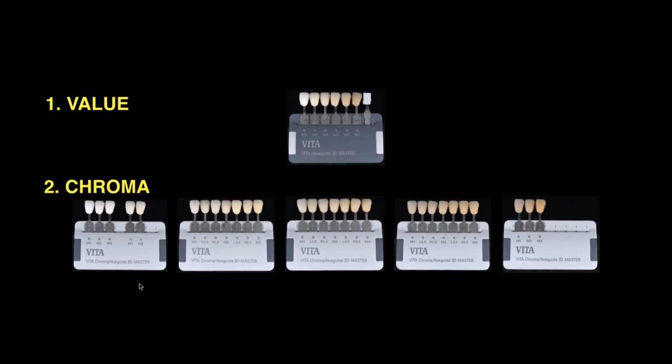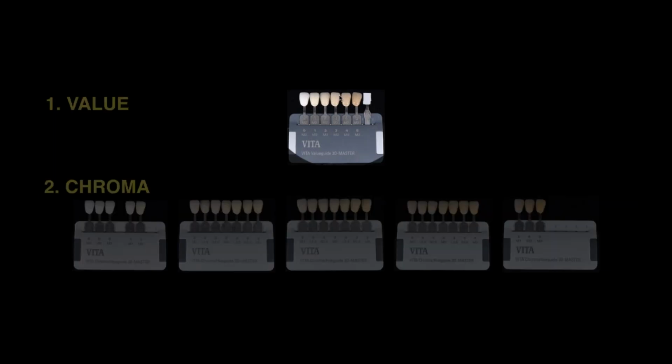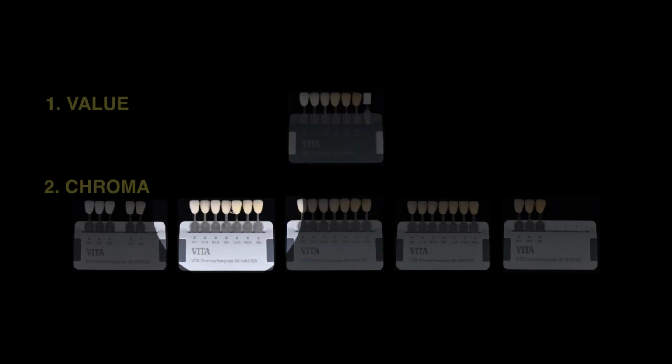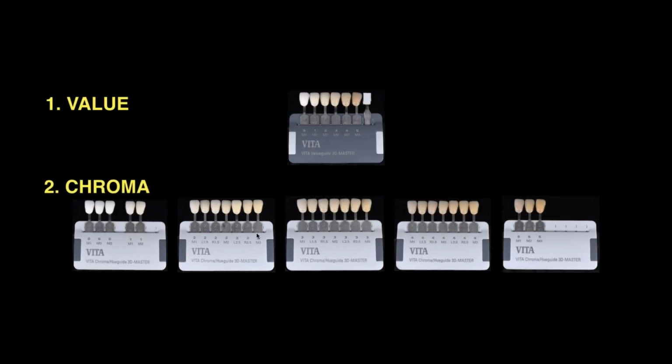So again, if I pick my 3M2 as the reference point, I go straight down to my 3M guide. And now I'm saying, okay, I know the values in the 3M2 world. Do I need more chroma or less chroma? Brighter and darker is the wrong term. I don't know why I keep using them. Once I get into the chroma, I'm really talking about the amount of color or the lack of color. And that's really the difference between value and translucencies, or the amount of light that's being absorbed into it.